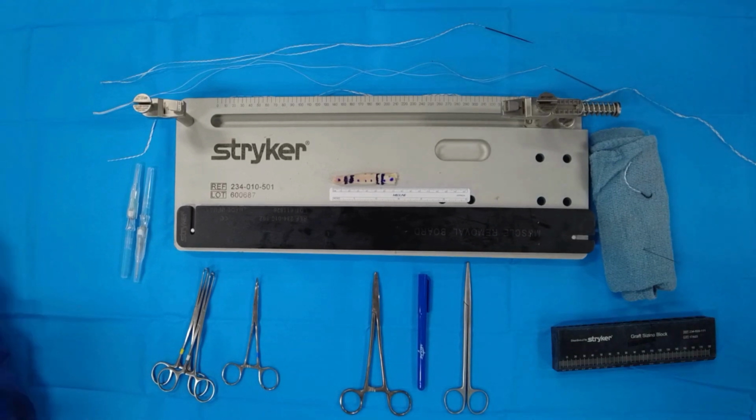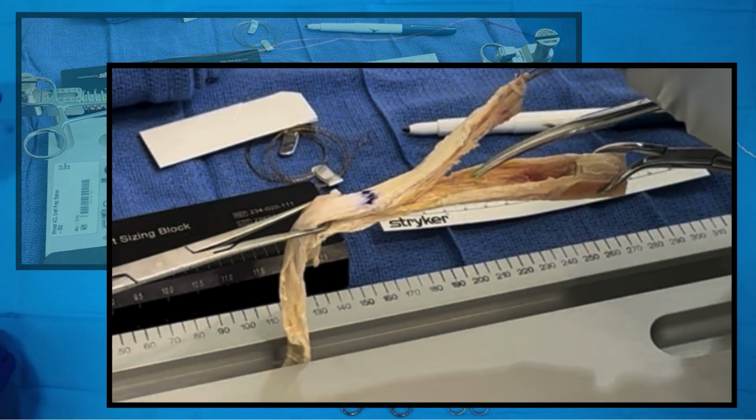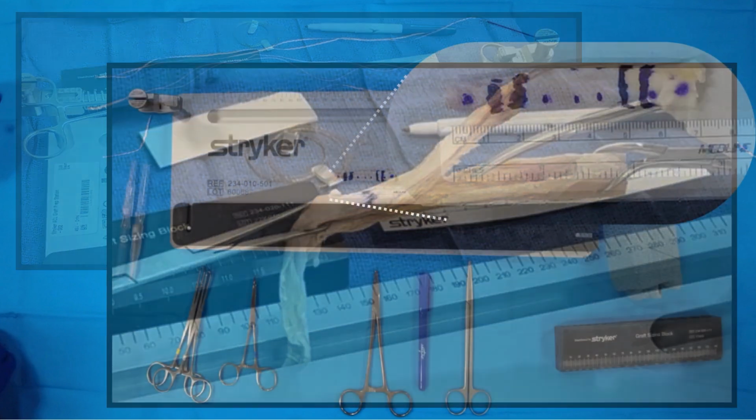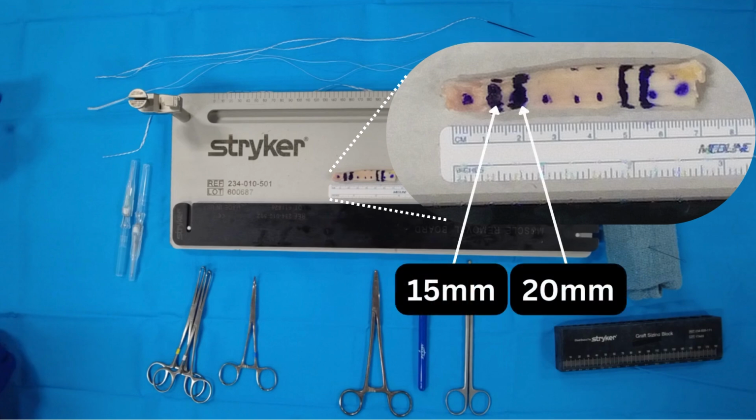And I'd just like to note that if you're going to be using quad allograft, it's a lot easier to make your cuts while it's still relatively frozen. And then as you begin to lift this, it'll become much more pliable, and this will save you some time and headache. But we're going to try and get about a 7-centimeter graft. Here I've placed two marks at one end, one on the other, just for purposes of this presentation. And our lines are going to be placed at 15 and 20 millimeters.